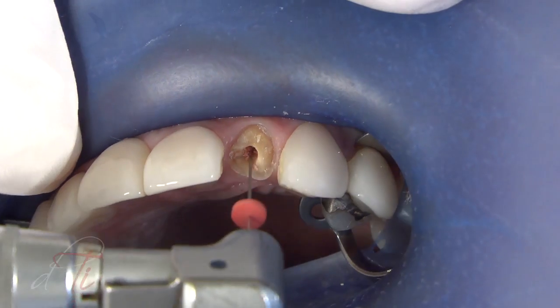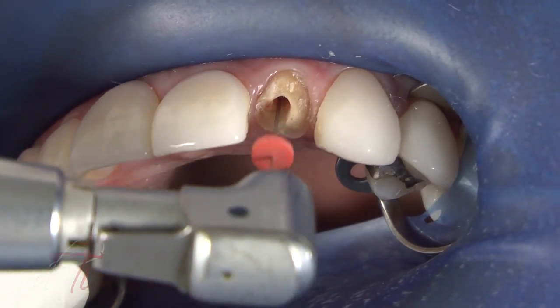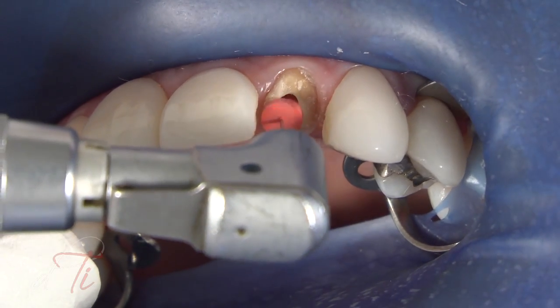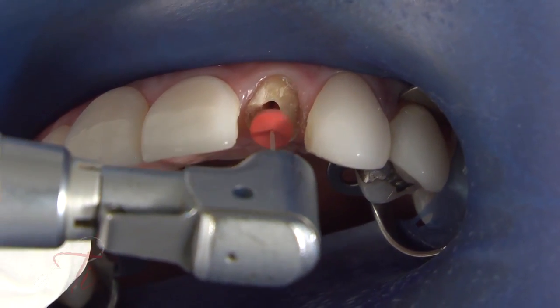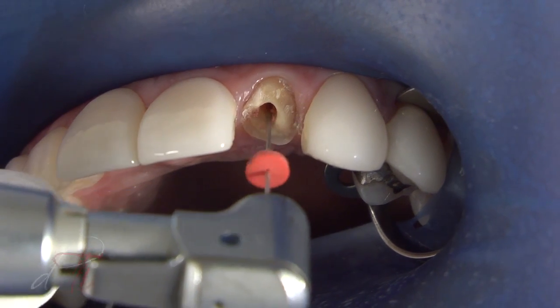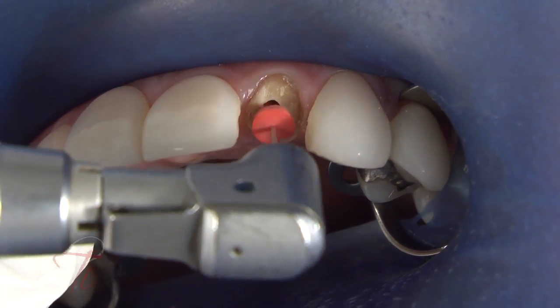It is important to be careful and not to touch the canal walls. A heated instrument can also be used to remove gutta percha. The channel preparation was shaped with color-coded pre-shaping drills used in sequence to establish the desired intra-radicular length and size for the selected post.